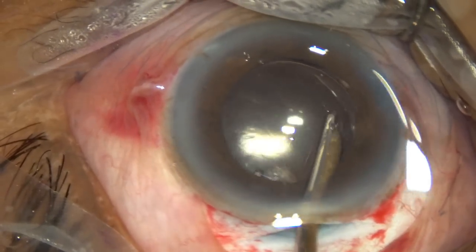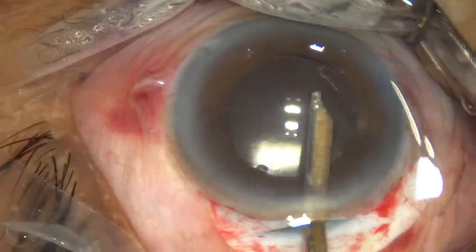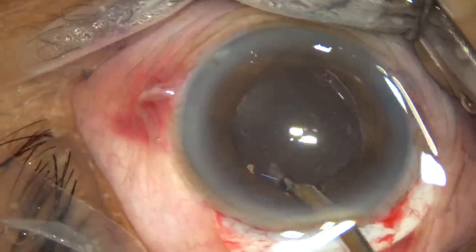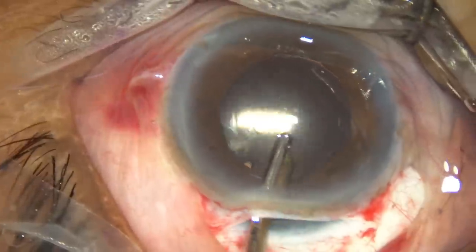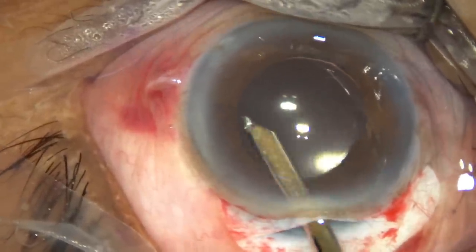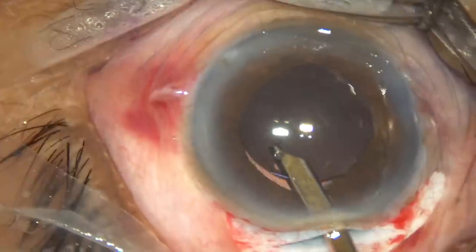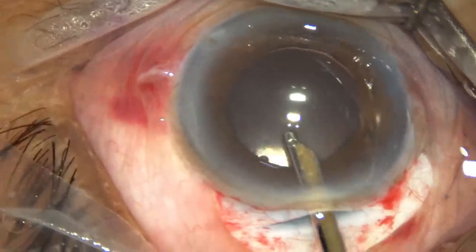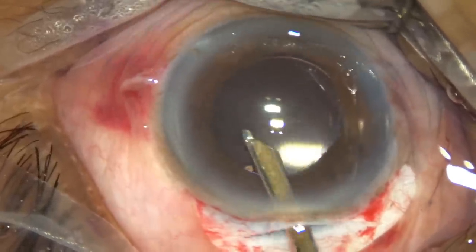Sometimes on the ocular surface we have a thick layer of visco, so we have to irrigate the ocular surface nicely to remove that layer of visco. PMMA lens, nicely centered in the capsular bag.